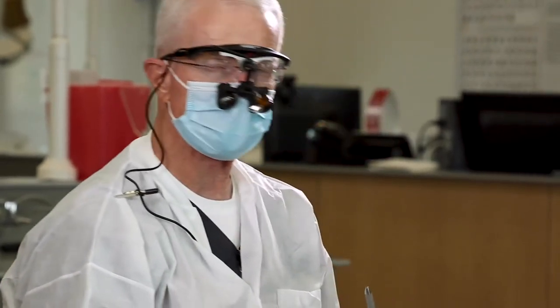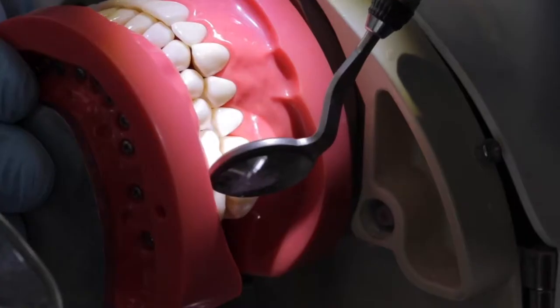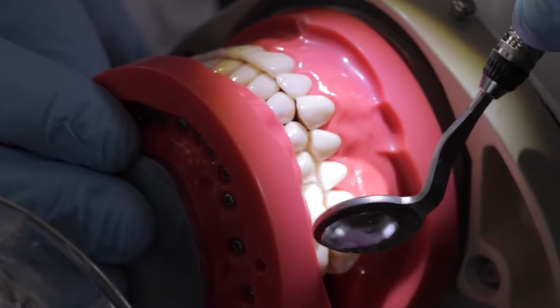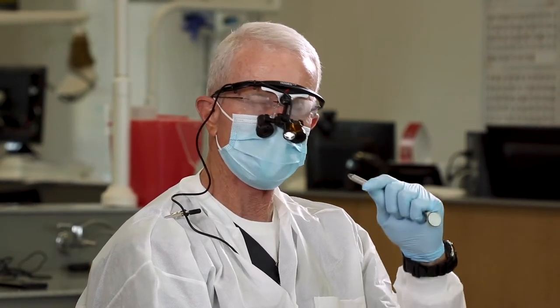As with any preparation, the first thing you'll do is take a look at the occlusion — have the patient close together and assess the occlusal relationship between the tooth that we're preparing and the opposing teeth. On this typodont, even though this is a class one occlusion, there's more inter-occlusal gap between number 14 and tooth number 19 in the lower arch near the distal aspect by about a half a millimeter.